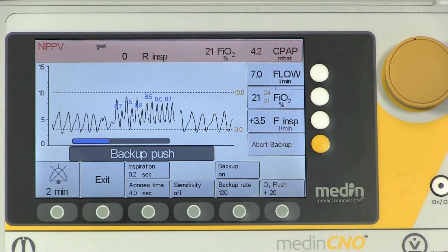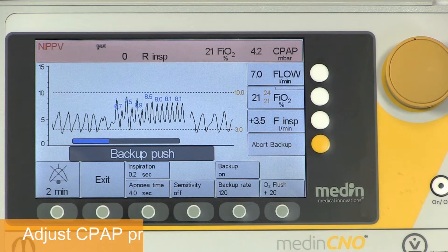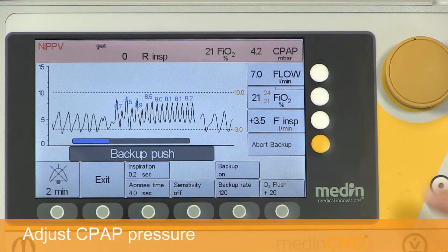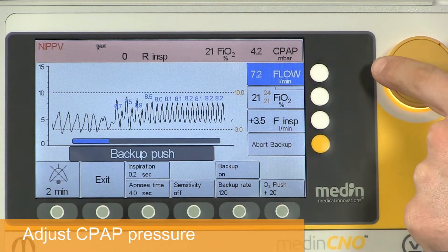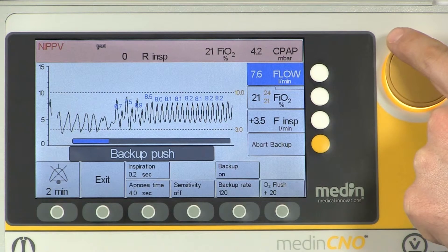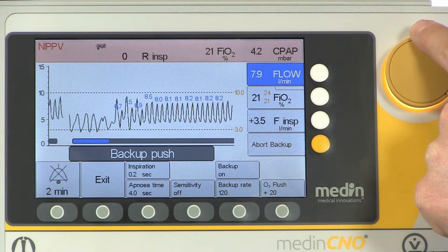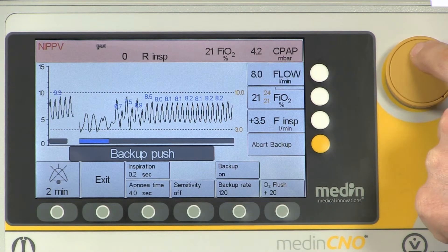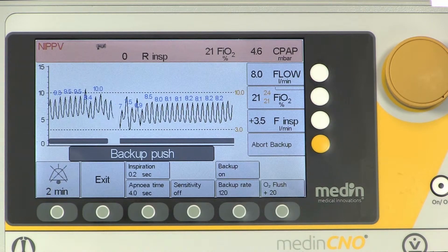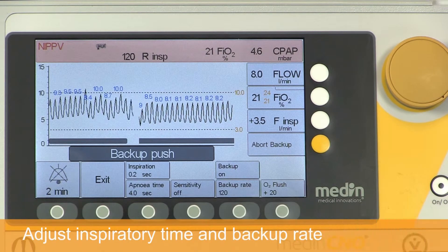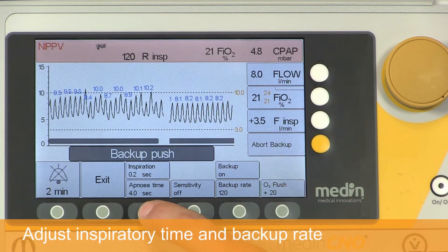As in all modes, you can adjust the CPAP pressure during non-invasive positive pressure ventilation over the basic flow. You also need to adjust the inspiratory time and the backup rate.